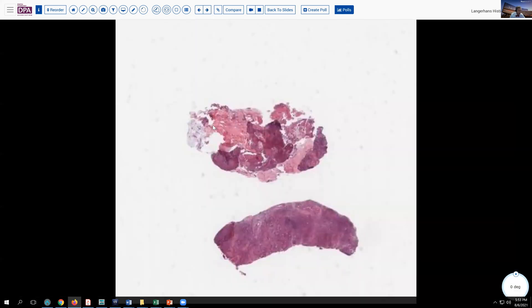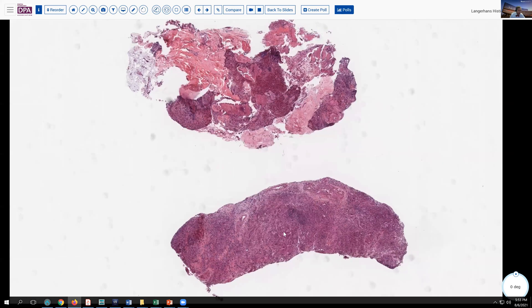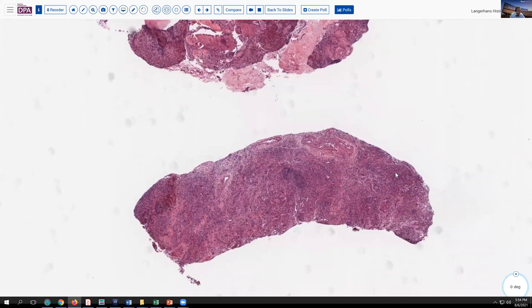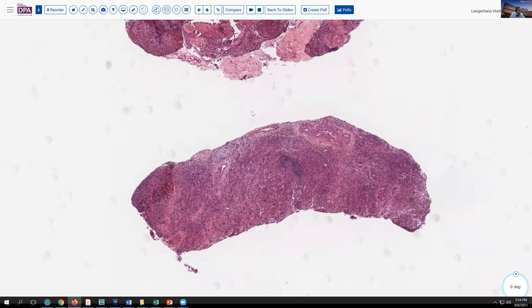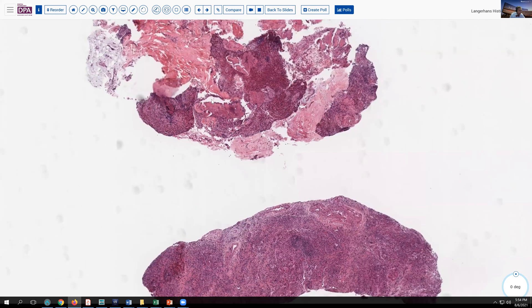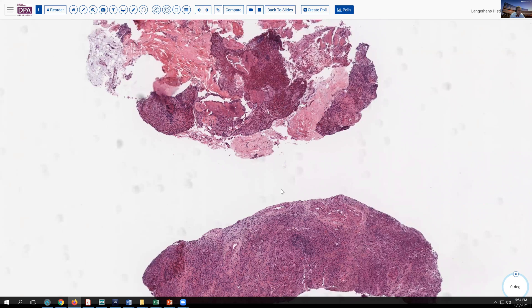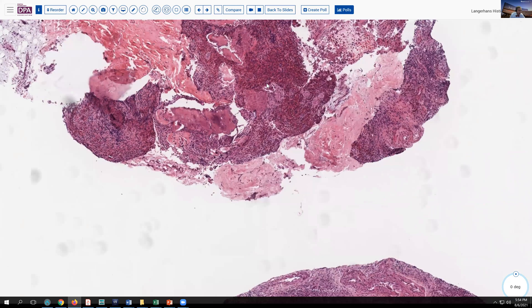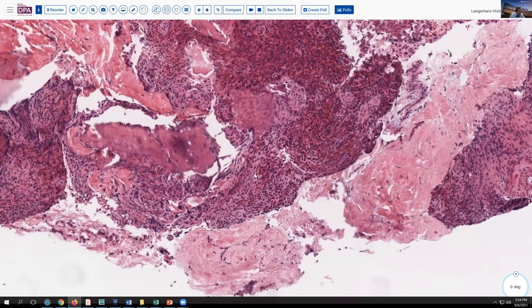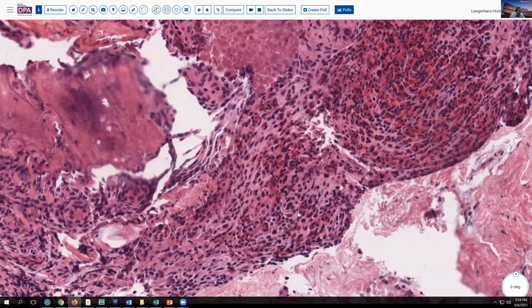Given its aggressive behavior, it seemed prudent to get some tissue to clarify that differential and allow us to plan next steps. Here we see a needle core biopsy. We see some amphiphilic color and heterogeneous nature of this tissue — a little bit of associated soft tissue, maybe a bone fragment or two. And looking here, we've got a lot of eosinophils. You can see them as these bright granular red granules here. That may have given you the clue right away that likely here we're dealing with eosinophilic granuloma.